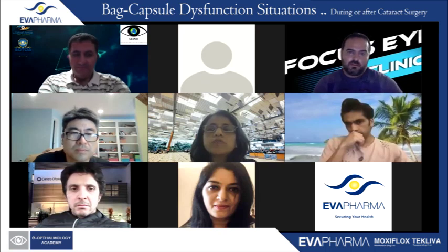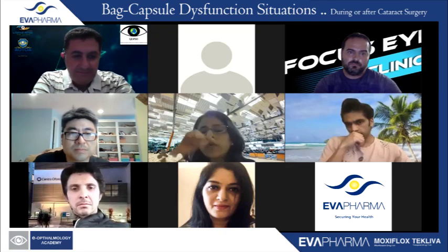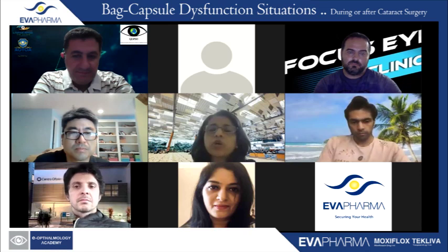So in my first video, I did inside out. In the second video, I was doing outside in. So you can do it either ab interno or ab externo. If you're doing it from outside in, you need to make sure that you're going very horizontal and not downwards into the vitreous cavity. Your question is how to avoid bleeding.